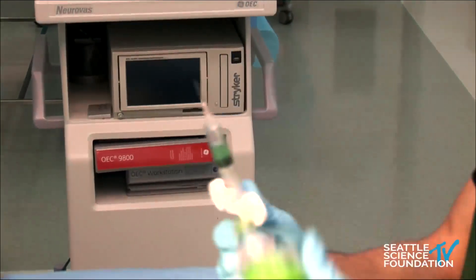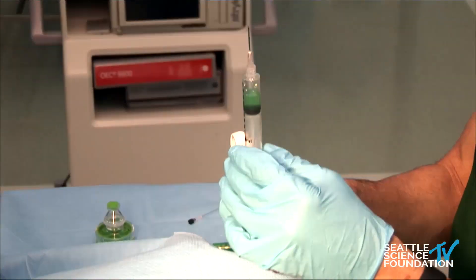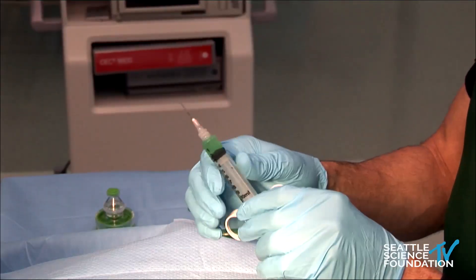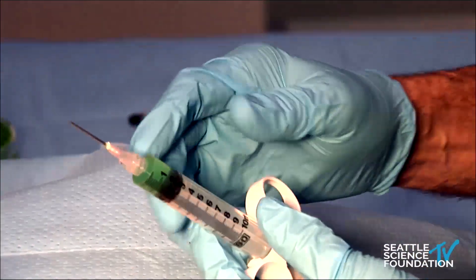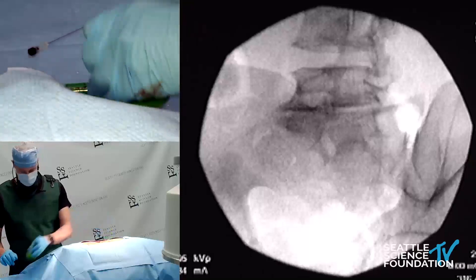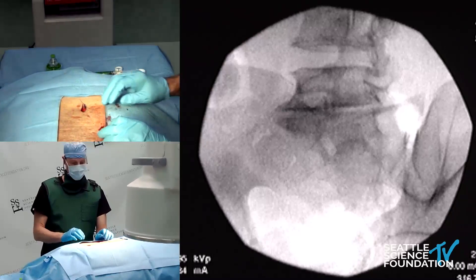I abbreviated the mixing times for the demonstration. The material is placed in a syringe — it is about the consistency of a thin paste — and it is injected through a 22-gauge spinal needle. The intervertebral disc is accessed with nothing more than a 22-gauge needle.